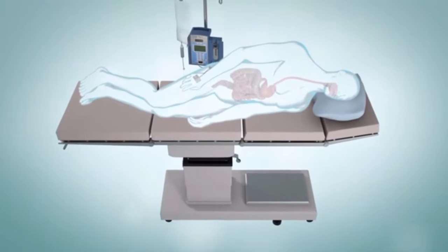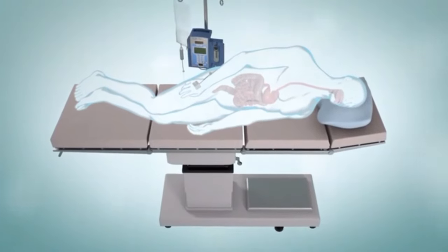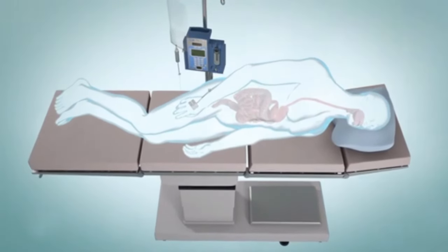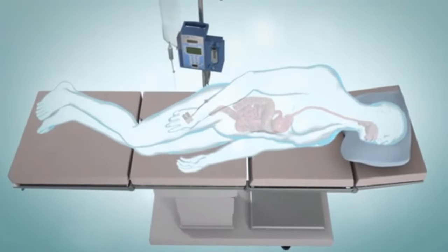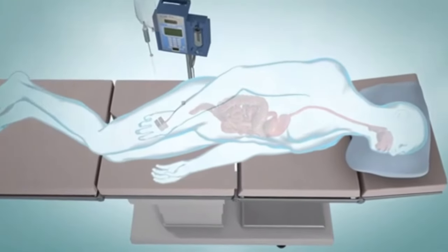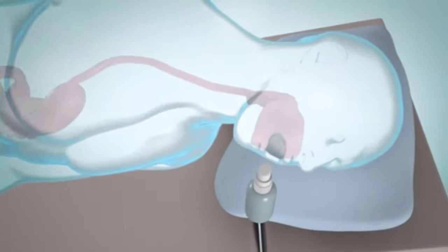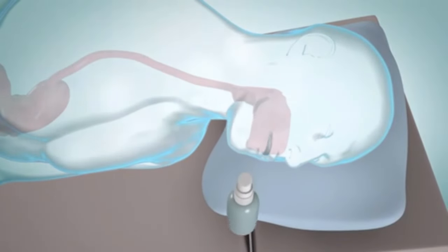An upper endoscopy takes about 20 to 30 minutes. When it's time for your test, you may be given medicine to help you relax or sleep — this is called sedation. This medicine is usually given through an intravenous line put in a vein in your arm or hand. Your throat might be numbed with a spray or liquid, and you'll be given a small plastic guard to protect your teeth.